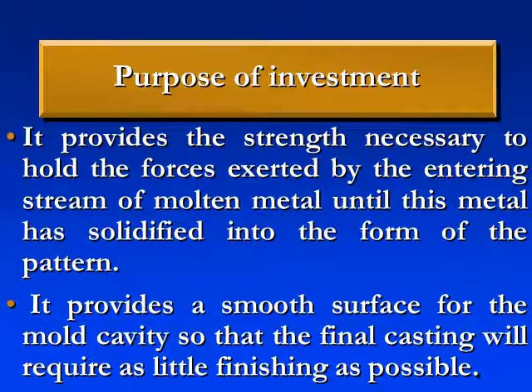Now, what is the purpose of the investment material? Why are we investing the wax pattern? The investment material provides the strength, because the metal needs a strong investment during casting. It provides the strength necessary to withstand the forces exerted by the entering flow stream of the molten metal until the metal has totally solidified in the form of the wax pattern, so that we reach the metal framework.